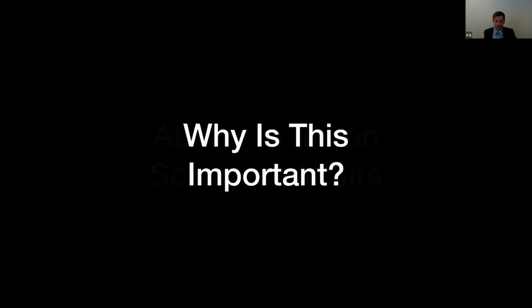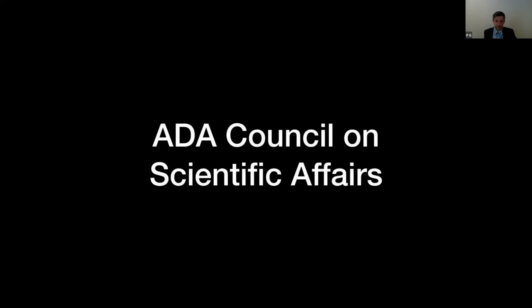So why is this all important? You know, there are some suggestions put forward by the ADA. In 2012, they came out with an advisory statement about the use of cone beam. Fairly quick read, and we'll highlight some of the key points that they made at the beginning and the end of the presentation.